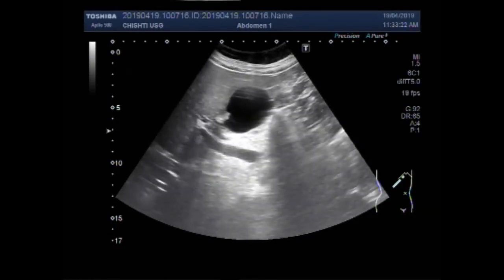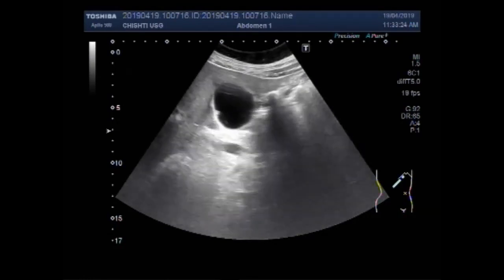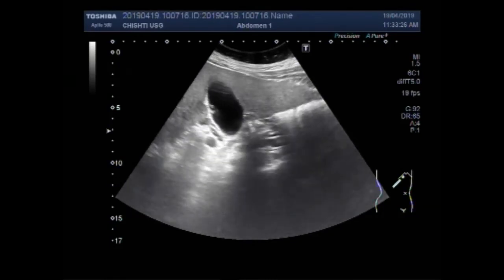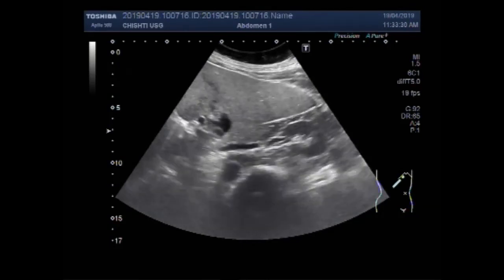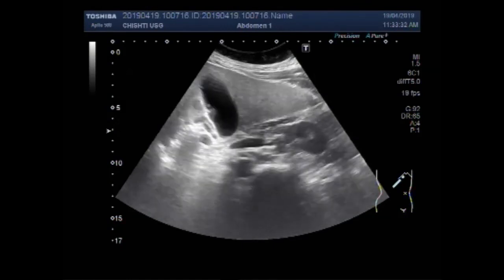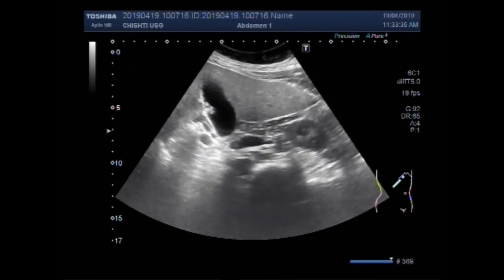Another try to focus on these gallbladder polyps. Now again you can see these are the polyps in the gallbladder along the interior wall of the gallbladder.